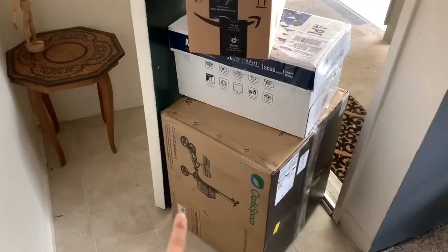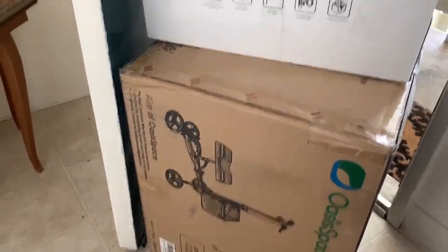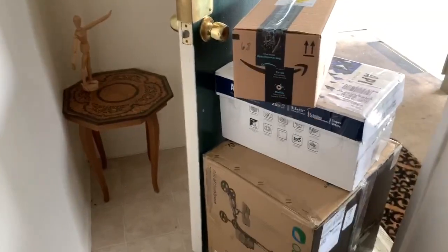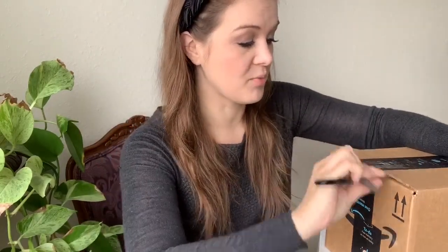UPS just came by and delivered a huge stack of boxes. That one definitely looks like my knee scooter — there's a giant picture of a knee scooter on it — but I have no idea what's in these other ones. There's an Amazon box and this random paper box, so I guess we can open them together and find out. I'm really curious about these top ones.